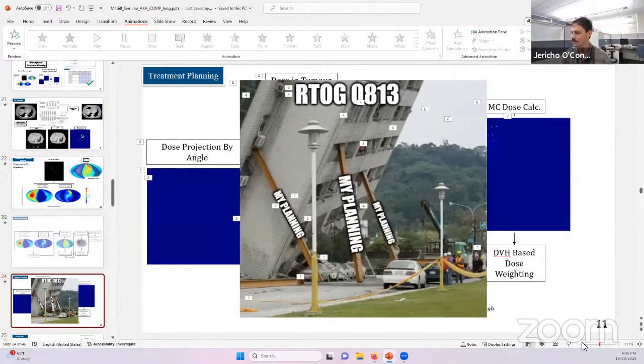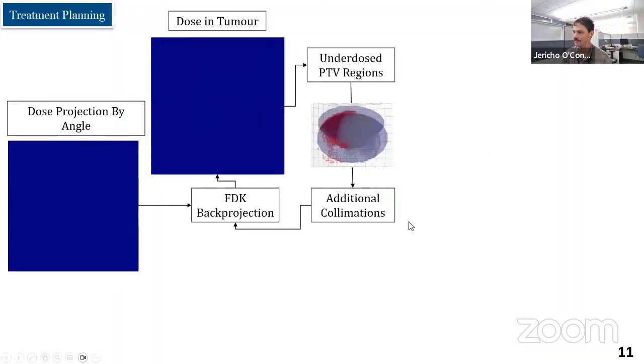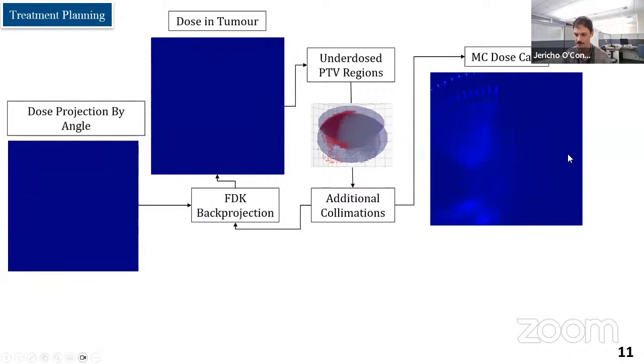Right now, what is time consuming is that ideally we'd want something that's not Monte Carlo, because we do Monte Carlo dose calculations. A big thing we're working on is trying to get an analytical model that can do our dose calculations, because you can't really use Eclipse because they don't handle kV beams. So we'd want to make our own in-house dose calculation. Right now that's the big roadblock. This is all pretty fast, but then we do a Monte Carlo dose calculation, which depends on how many cores, but takes a couple hours to a day. So that's what's really slow. Does that answer your question? Cool. Yeah, thank you so much.